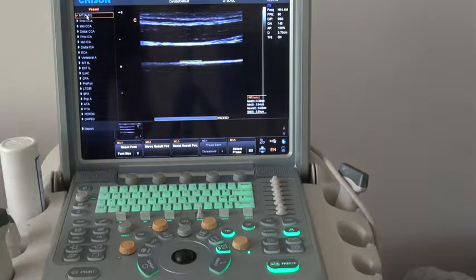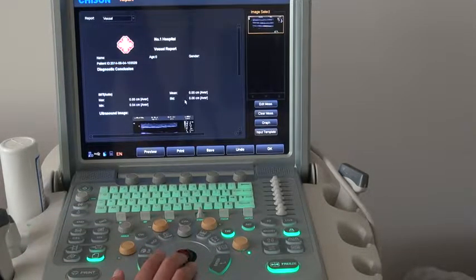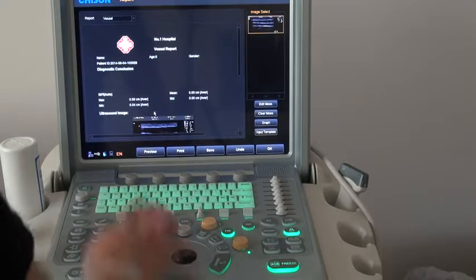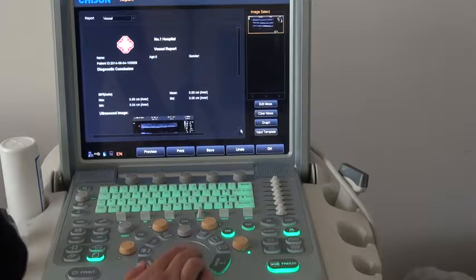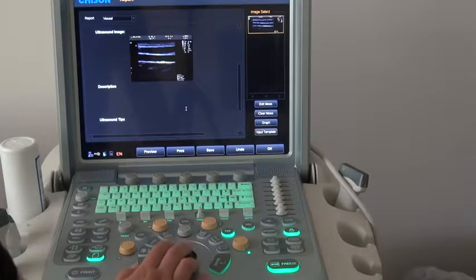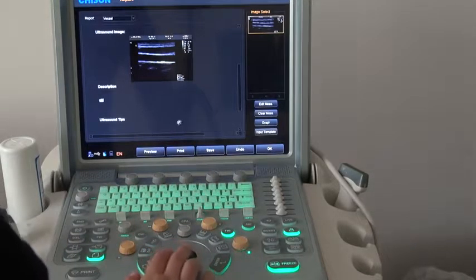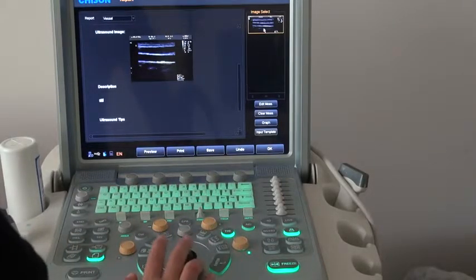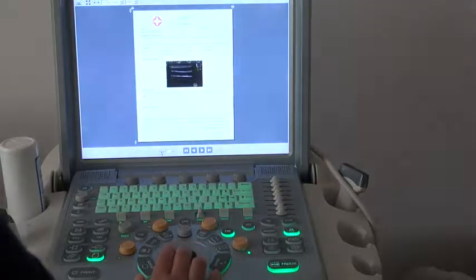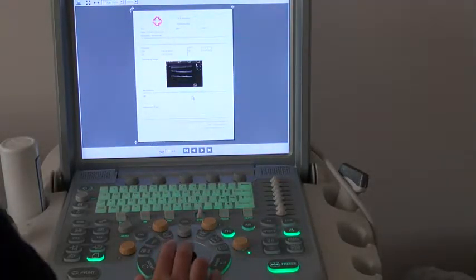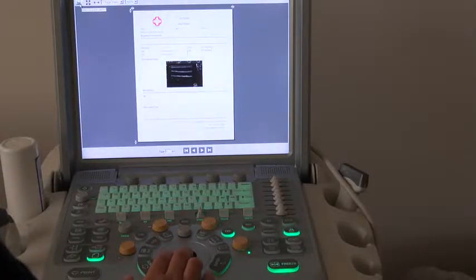After that, press the report key. The system will show us the report. We can find the calculation results are also shown in the report. Here we can import a diagnosis conclusion, and select the images we saved. Then we can preview — it's A4 paper format — to see what the report looks like before printing. This button is one-key print.